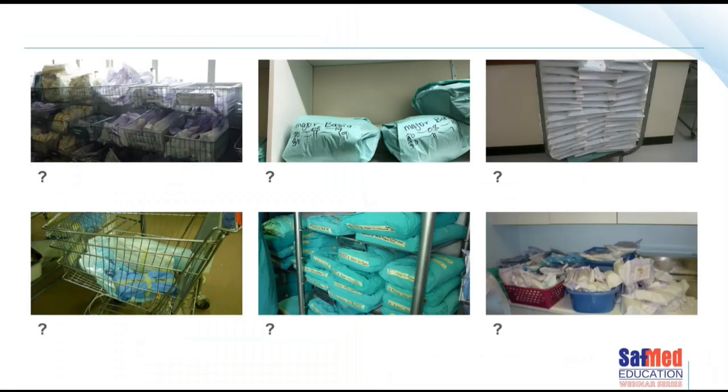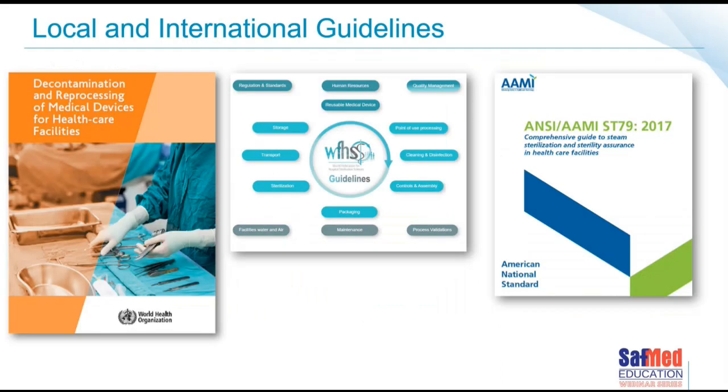Do the conditions in the storeroom matter? Should we store our packs on wooden shelves? Should we transport our sterilized sets and packs in open trolleys or in supermarket trolleys? Does it matter if we compress our sets? Does it matter if we compress our packs? Does the condition of the shelving even matter? You may ask yourself that question. And the answer truly is yes. How do I know that? Because I read the guidelines.